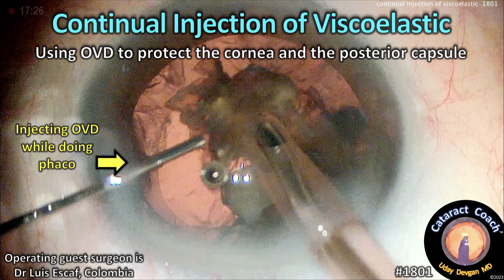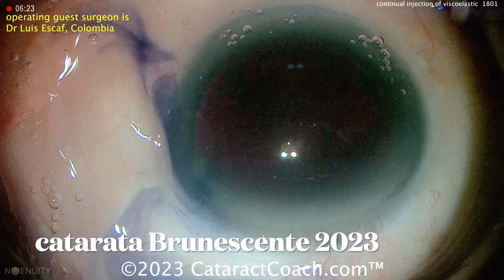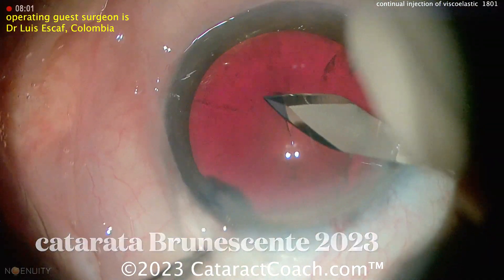Continual injection of viscoelastic — using OVD to protect the cornea and the posterior capsule for a real dense brunescent cataract. Let's watch our surgeon here. So Trypan Blue Dye, getting the rhexis done here.